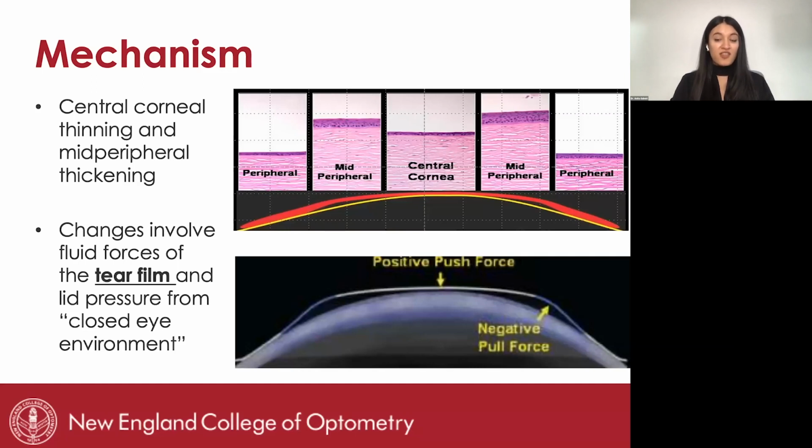This hypothesis is that a thin layer of tear film exists between the back of the Ortho-K lens and the central cornea, and these tear film shear forces act hydraulically to create a compression force when the eyelid is closed. There's another theory that says Ortho-K wear changes myopic correction by actually bending the cornea to reshape it. And then we know these changes are temporary. So the cornea is elastic and has a memory. So the cornea will resume its pre-Ortho-K shape once lens wear has been discontinued.